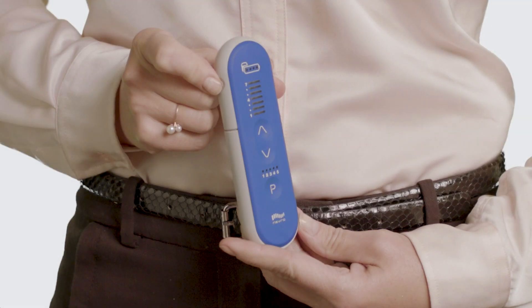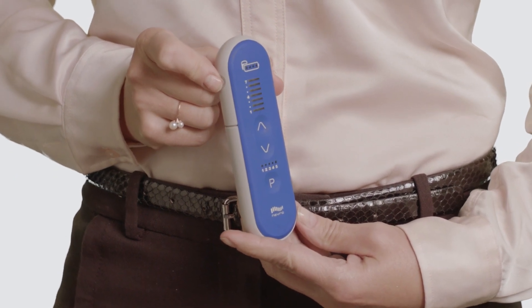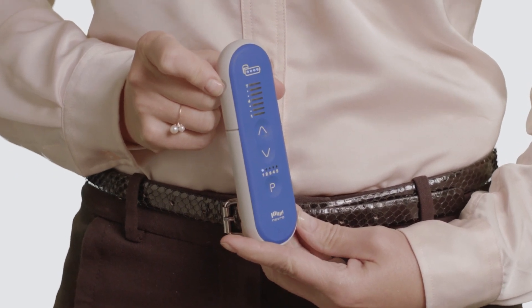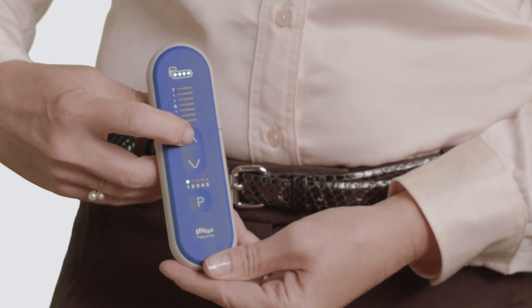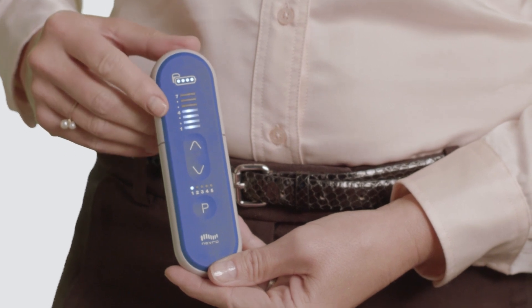To exit the impedance check mode, press the on/off button on the side of your remote for five seconds until all lights on the remote turn off. When the remote is turned on next, it will return to normal mode. To turn stimulation back on, first turn the remote on using the on/off button, then press the up arrow once. You will now see illuminated number levels indicating stimulation is on and you can adjust program settings as needed.